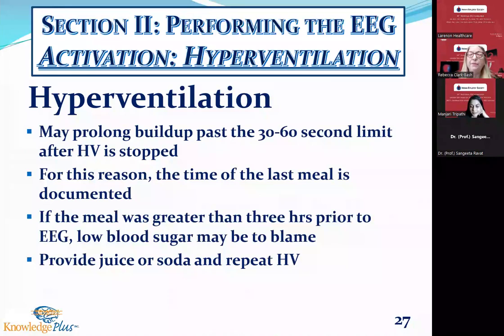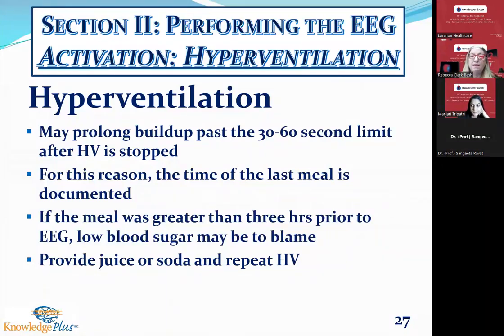So again, if they have hypoglycemia, it can prolong that buildup response. So we document the time of the last meal. And I think a 3-hour window is safe. So I want them to have a meal within 3 hours of their EEG. If it was greater than 3 hours and they have prolonged buildup response, it could be low blood sugar.